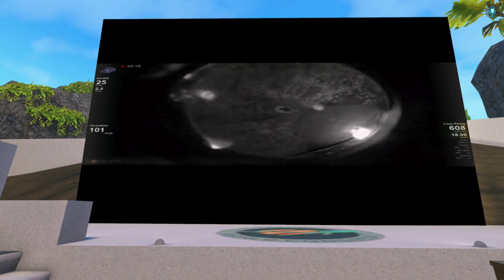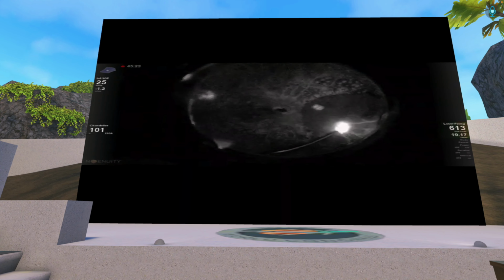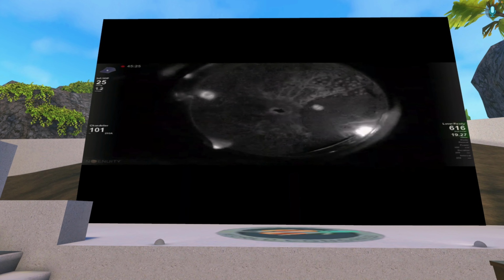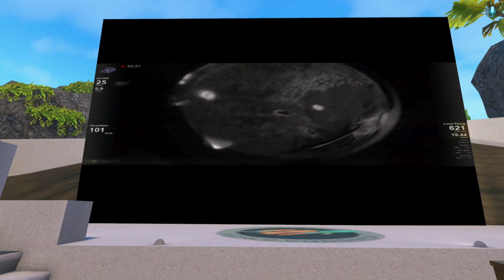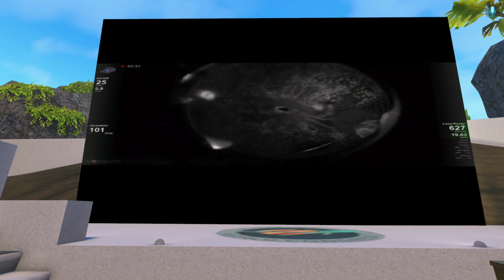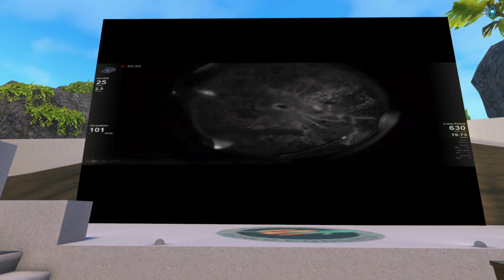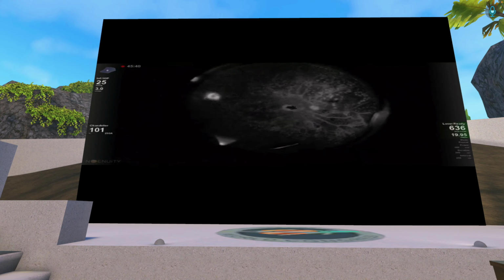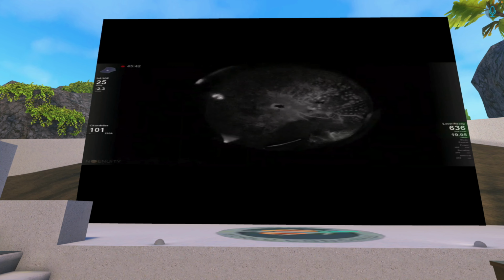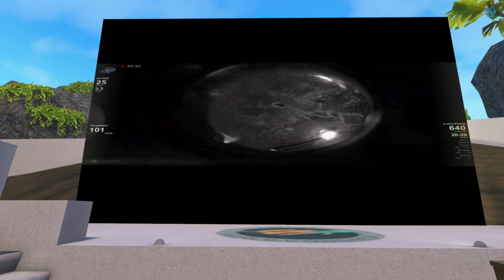We cannot remove the diabetes disease, unfortunately, from the patient, but still we can be more precise in treating the underlying pathology. So here I find quite useful the chandelier assisted intraoperative fluorescein angio, and with the proper digital filter settings you might have actually not bad image at all.